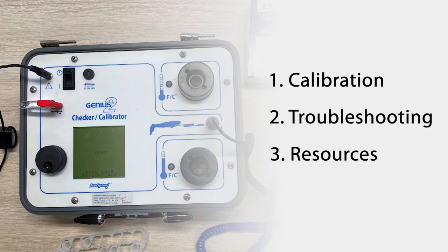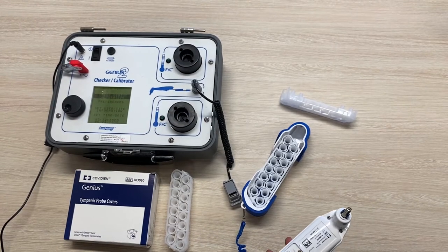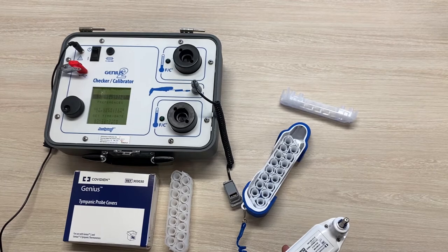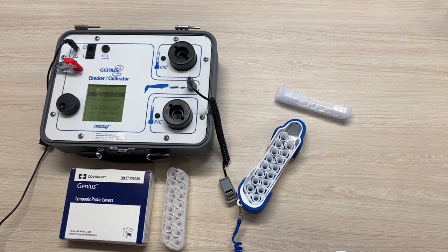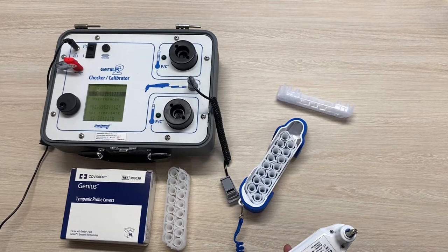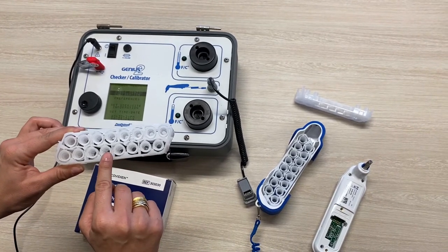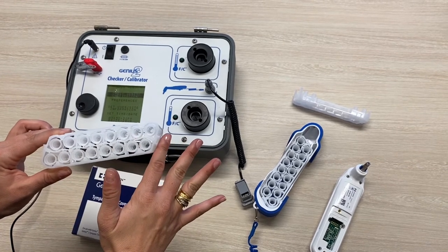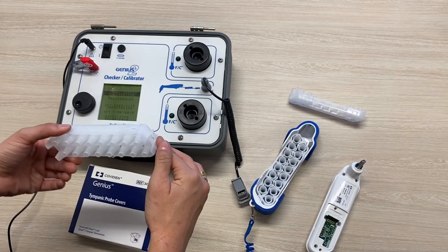The Genius calibrator can be used to calibrate both G2s and G3s. In preparation for the calibration, I suggest you set yourself up first. As you can see we have our probe covers ready to go. Please make sure you're using a new probe cover each time you switch from the high to the low targets and back. Do not touch them — oil from your fingers can contaminate the cover.